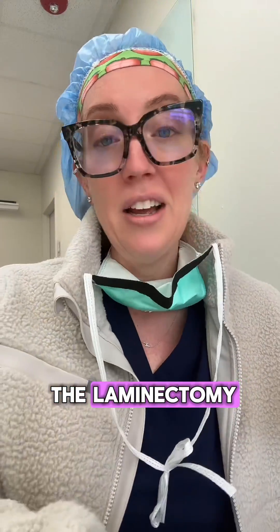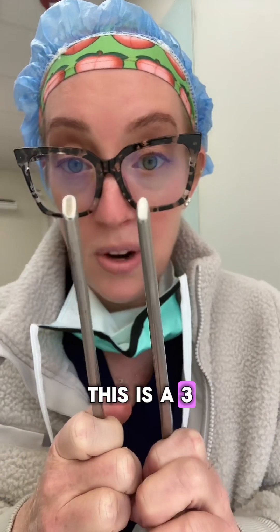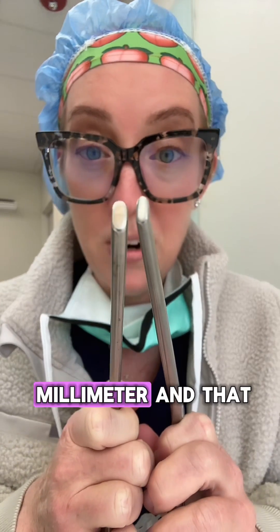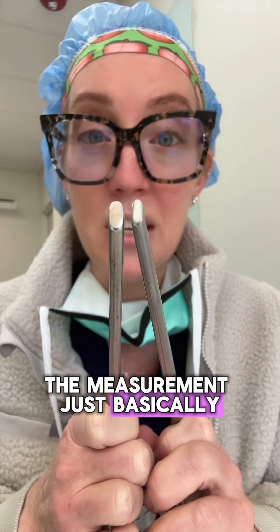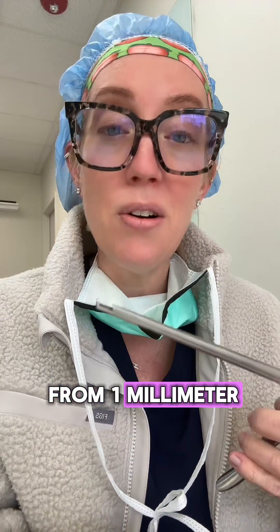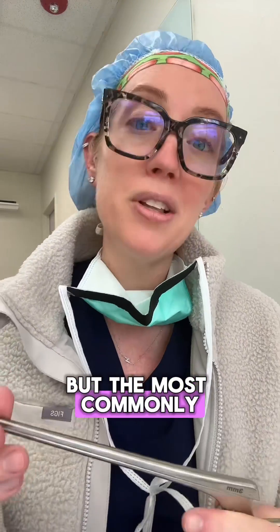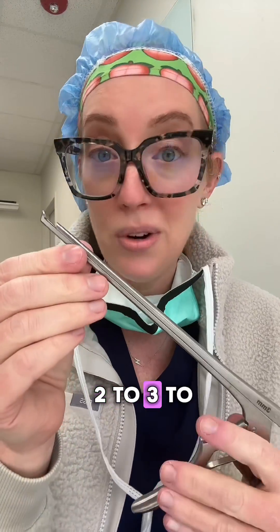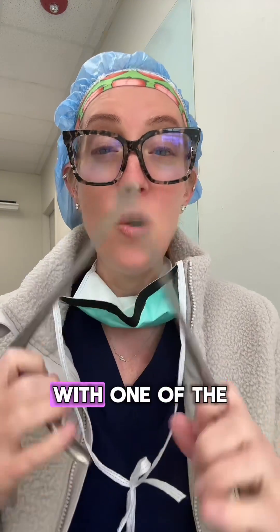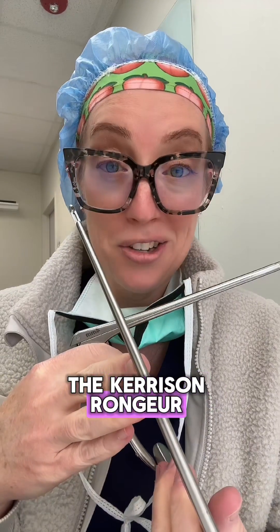Kerrison rongeurs come in many sizes. This is a three millimeter, which is my favorite size, and this is a four millimeter. The measurement tells us how wide that footprint is. They go anywhere from one millimeter all the way up to six or seven millimeters, but the most commonly used size is two to three to four millimeter. So that, my friends, is how we perform a laminectomy with one of the most common instruments in spine surgery — the Kerrison rongeur.